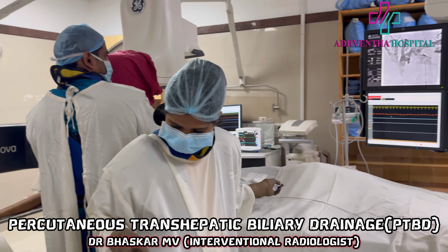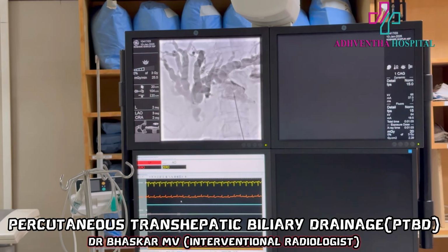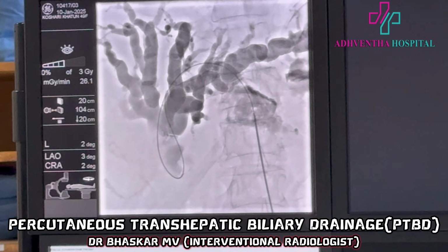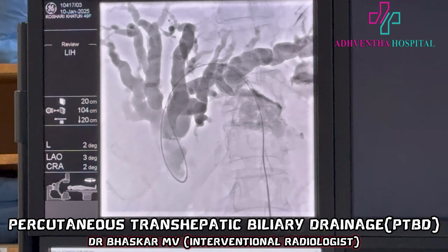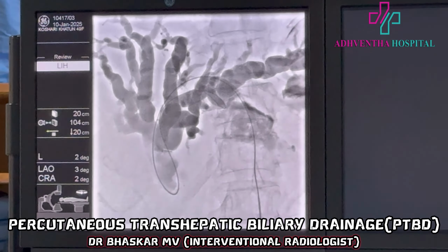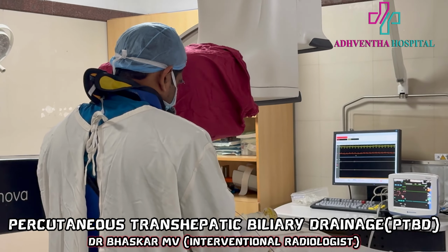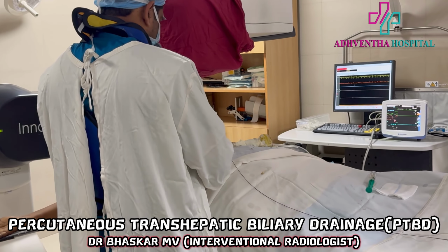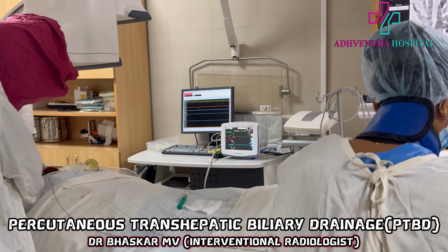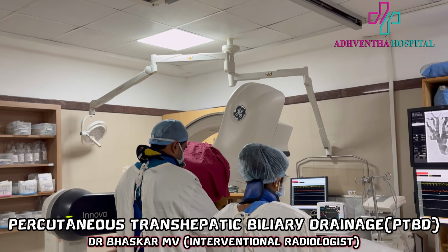Advantage is you can steer wherever you want. Now you have to place the sheath. Totally sheath, there won't be any biliary leak into the peritoneum, between the liver and the skin, biliary tree. So that the clean procedure will be there. The post-operative pain also is reduced.